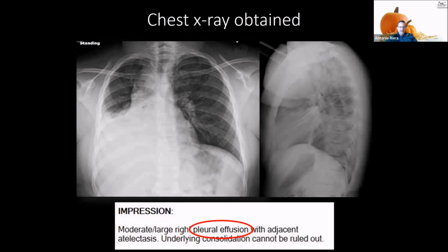Yeah, but that's something that you can do. But the inpatient service, our house staff on the hospital service, I think are less likely able to make an assessment like that. In terms of what I think Lei is trying to say, if you have an effusion that's so big, the heart, the midline, should be shifting the other way. But what I think we mostly do in our clinical practice is read the impression of what our radiology colleagues are evaluating.